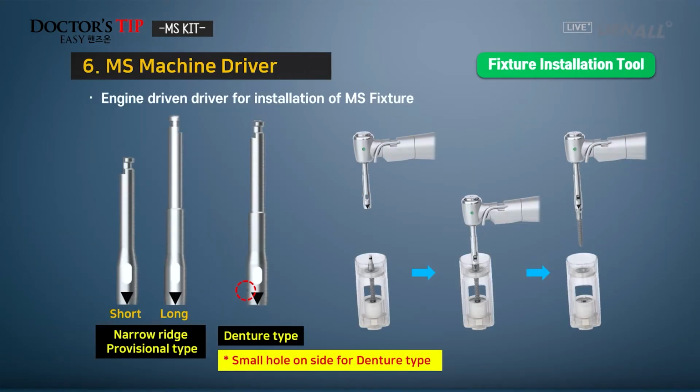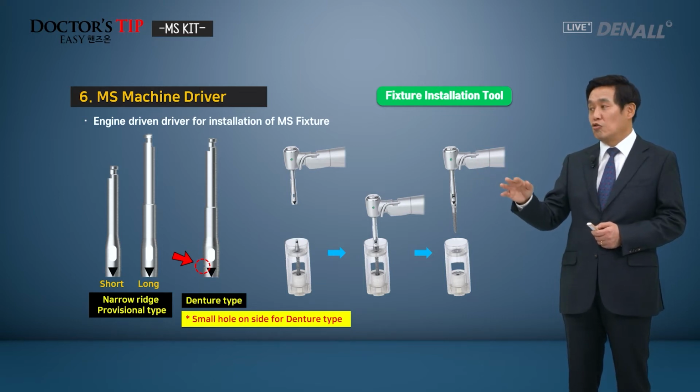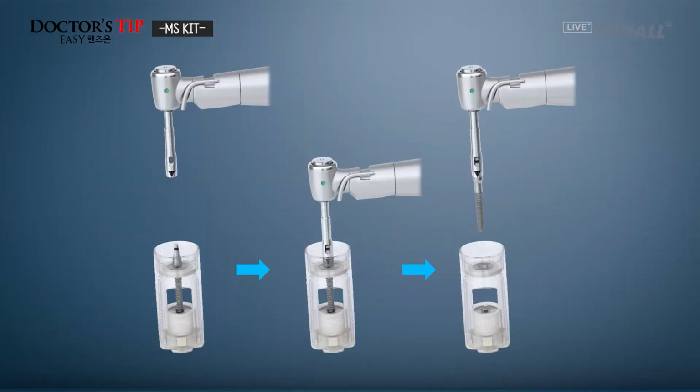Next is the engine-driven driver for installation of the MS fixture. You have short and long types, and for the denture type, you have a bit of a notch or hole at the bottom. So you can distinguish the denture type from other types. And I will show you again in the hands-on. With this engine-driven driver, the black triangle part, you connect to the flat part of the fixture, then it will be easy to place the implant.